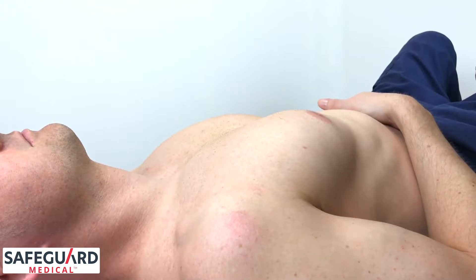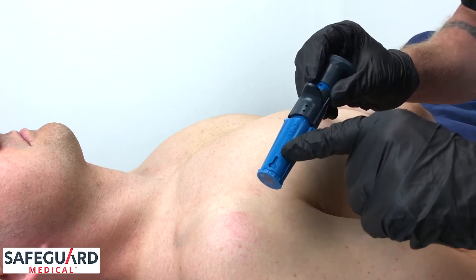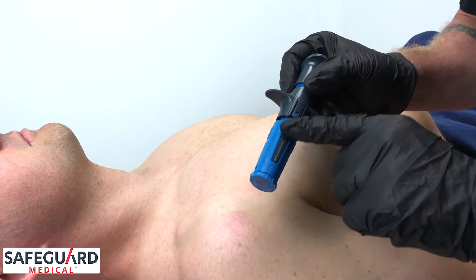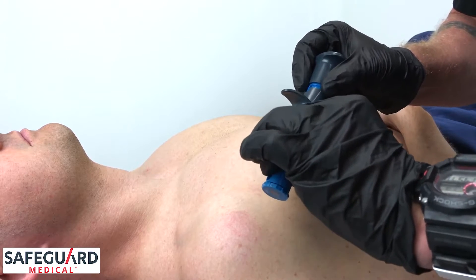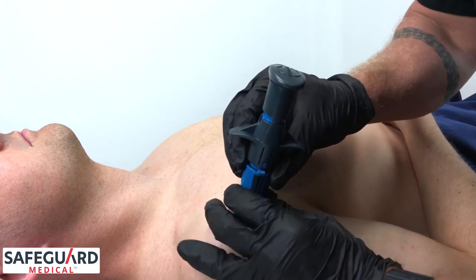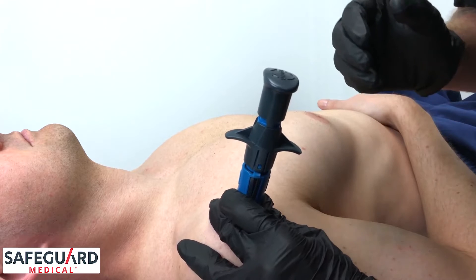Once the insertion site has been located and prepped, grasp the neo by the textured dots, taking care not to place a finger over the stabilizer locking tabs. Grabbing the textured dots, place the neo over the insertion site, utilizing the palm and fingers of that hand to stabilize the neo.